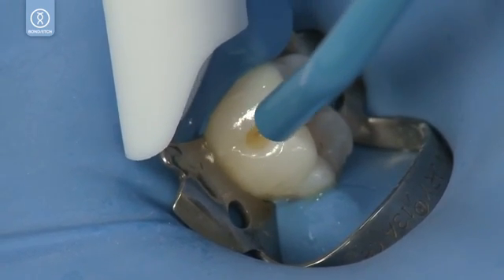Optionally, seal the surface of the composite with Permaseal. To learn more about Peak Universal Bond, visit Ultradent.com or contact your Ultradent representative.